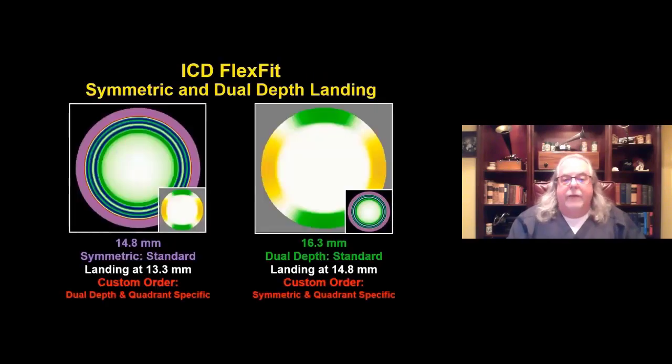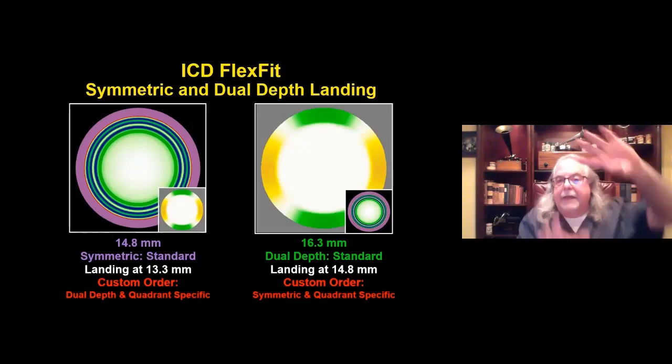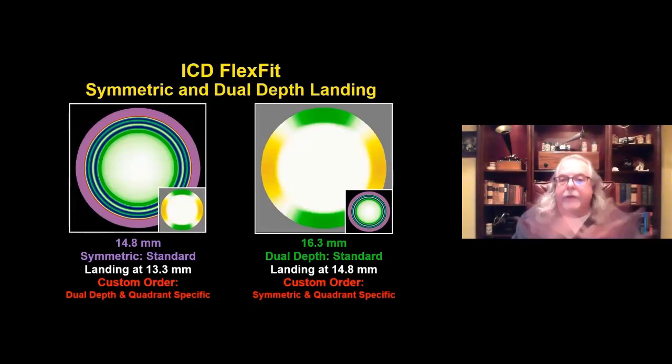This was really discovered in studies that we did at Pacific University, where we found that on 16.3 diameter lenses, the average amount of difference in height between the two principal flat and steep meridians was 125 microns.